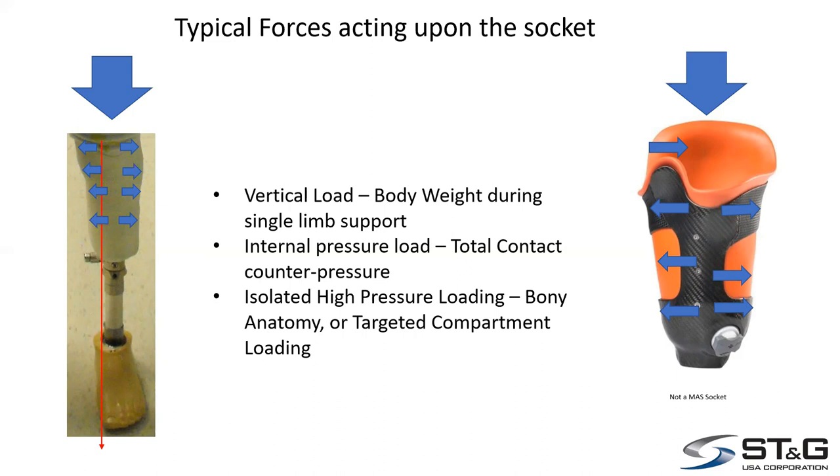The other thing is, depending on where you have any bony areas, now you're relieving that and you're distributing some of that load around it. So we don't want to arbitrarily cut away some of the high pressure relieving areas that are taking some of the load and leave in where the bony area is. Now you're loading a part that's not really dispersing any pressure.